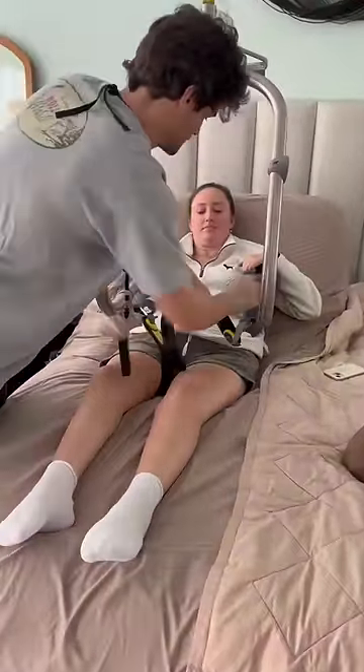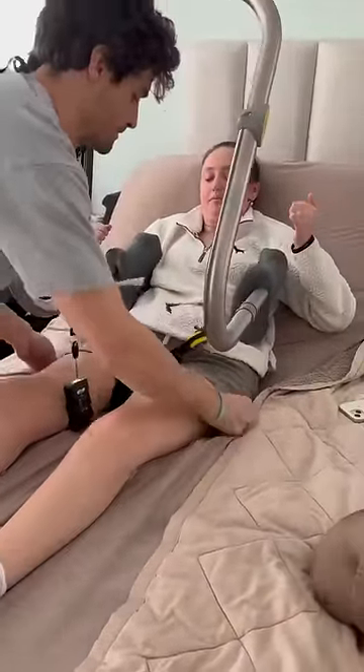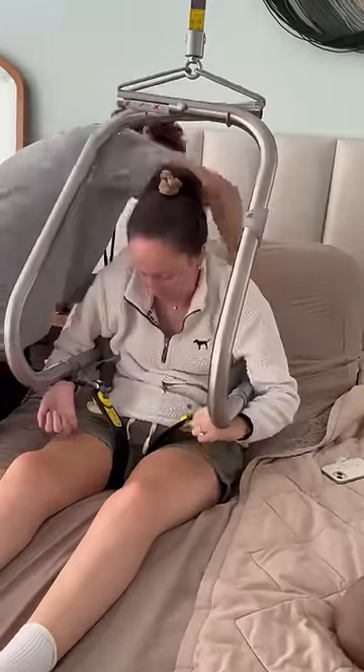We are putting the hooks on the inside of my thighs because a lot of people said it was easier this way, and I agree it's a lot easier. They don't slip out as easily and it's easier to get them up higher.